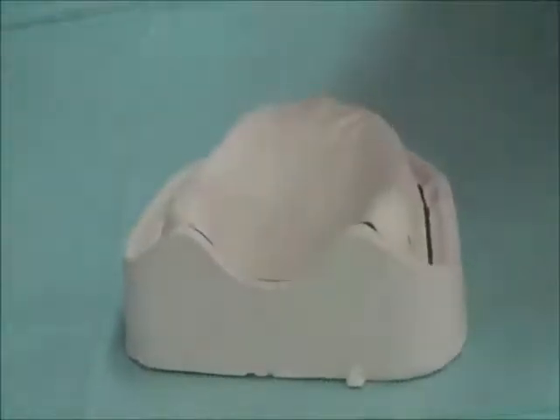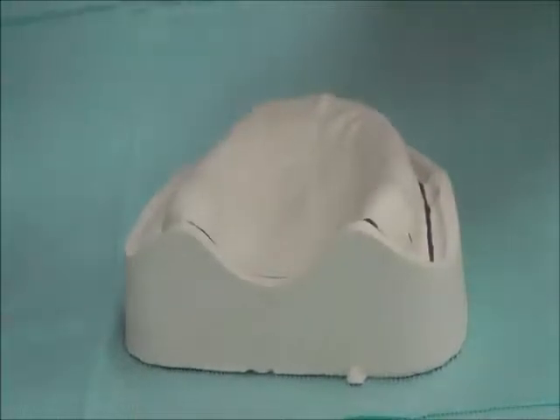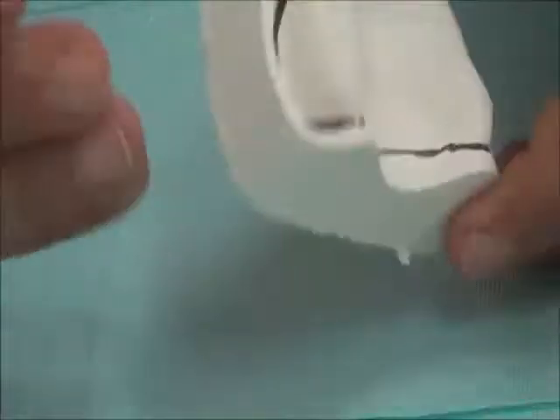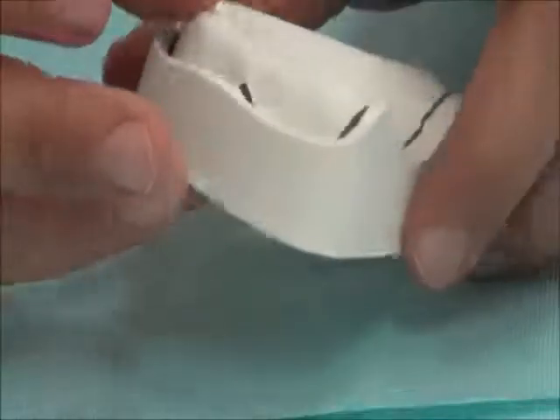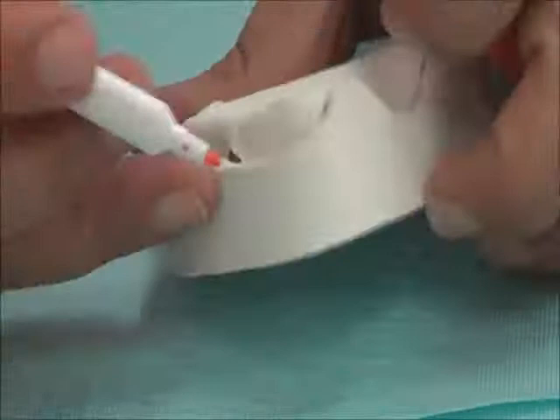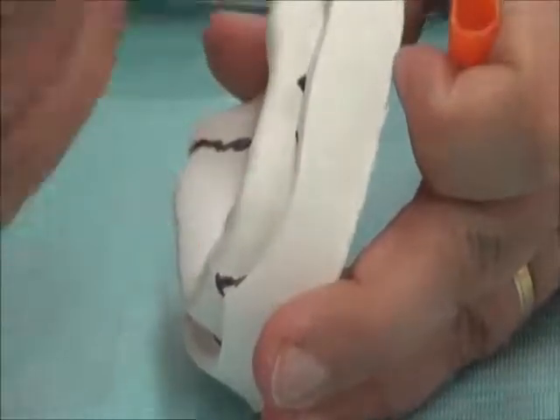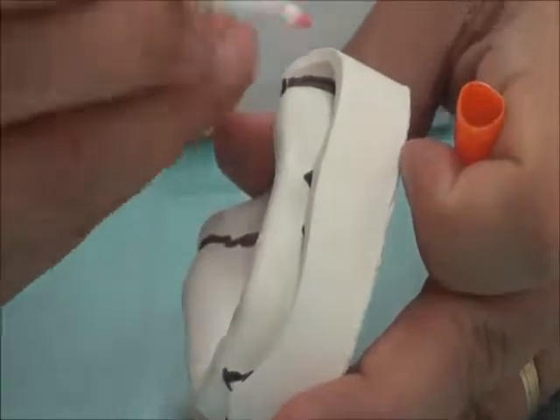This is what we call the full sulcus depth. This will not be the outline of our tray. The outline of the tray is far away from this by 2 millimeters. So when I'm going to draw the outline for my tray, I should draw the same line, the same morphology of the line, but 2 millimeters away from the depth of the sulcus.